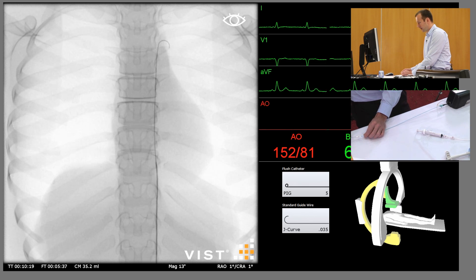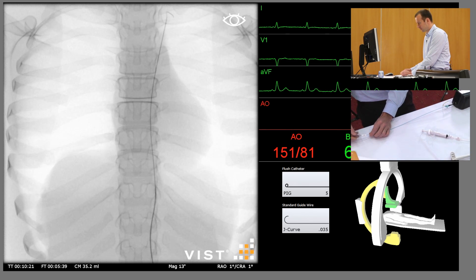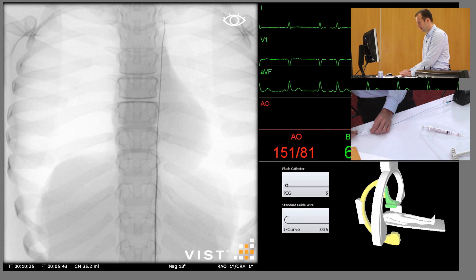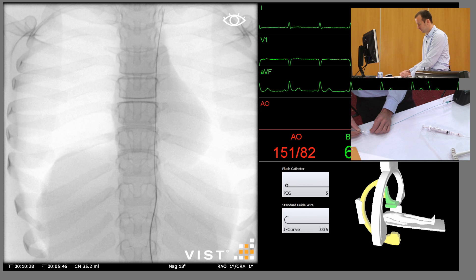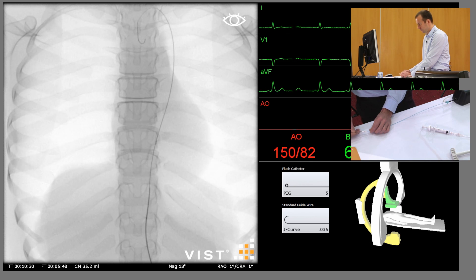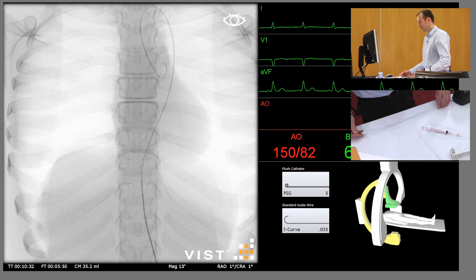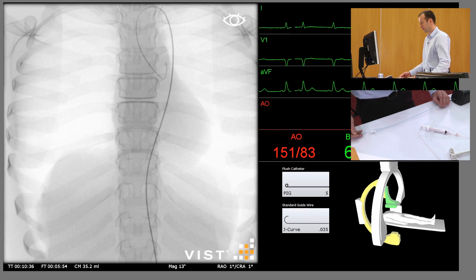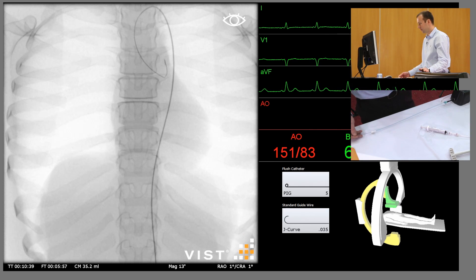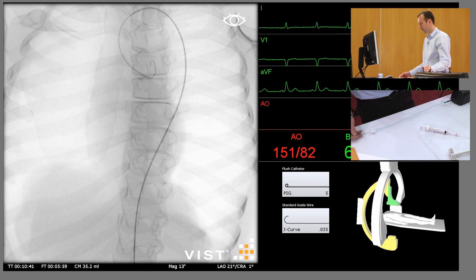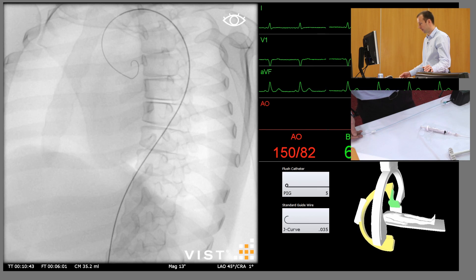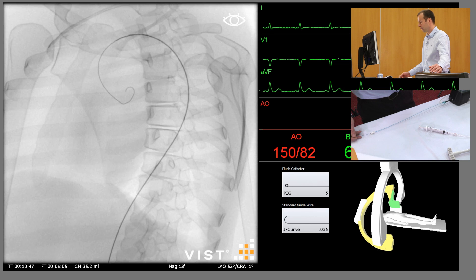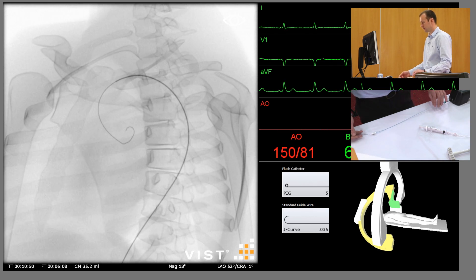I'm going to advance the guide wire around the aortic arch — it's just gone into one of the head and neck vessels there — into the ascending thoracic aorta. We're going to follow that with a pigtail catheter, and we get a far better view if we swing the C-arm, the image intensifier, round into the left anterior oblique, and we'll just centre the imaging over the aortic arch.